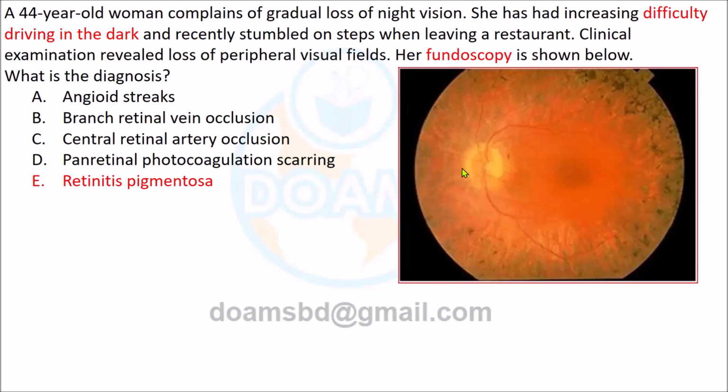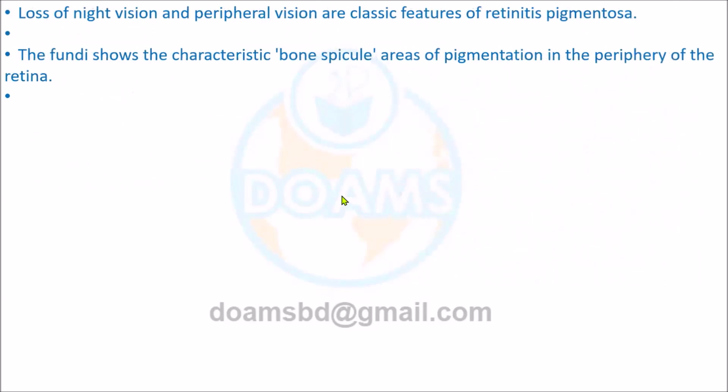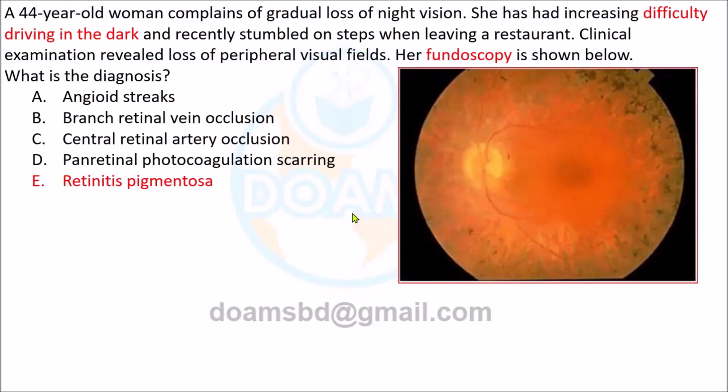Another thing I would like to say, as you stopped me, it is nice, otherwise I might forget. This is called waxy retina, waxy disc. As I said, you will say it is normal or near normal, but it is called the waxy retina. Sir, what is the reason for the reduced arteries here?